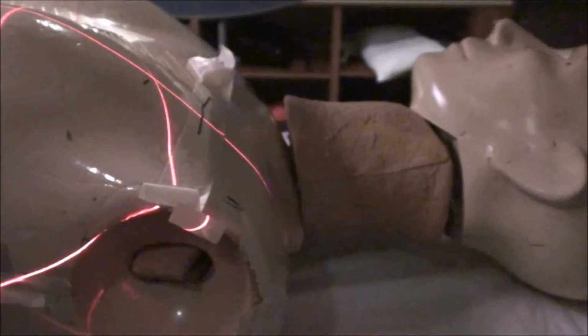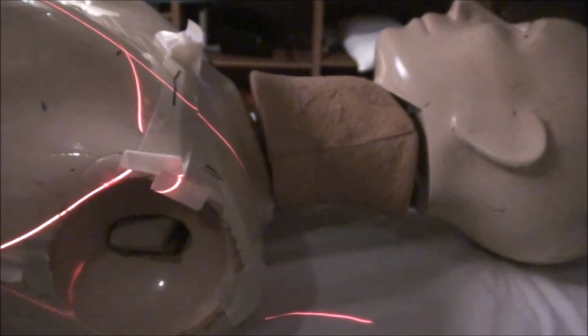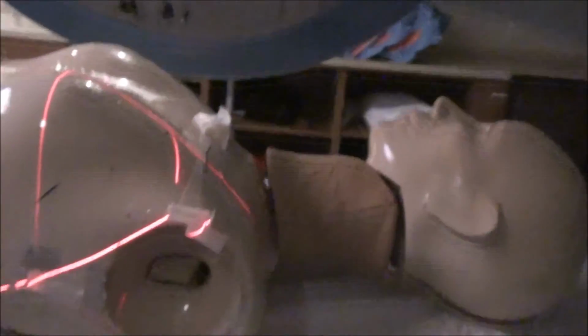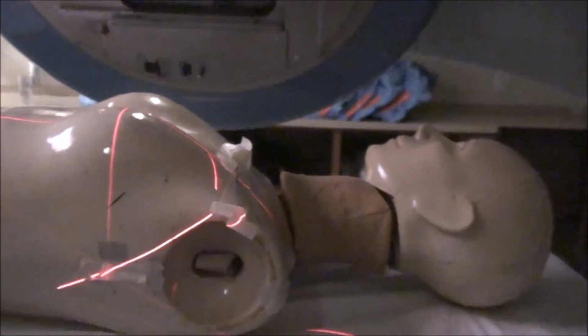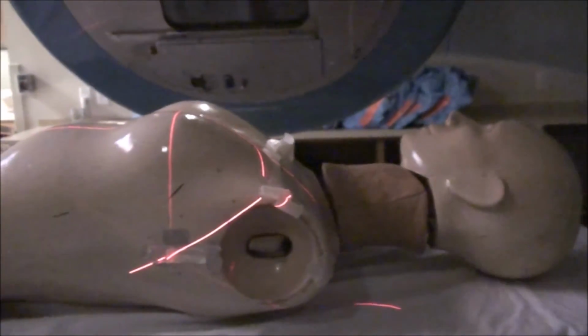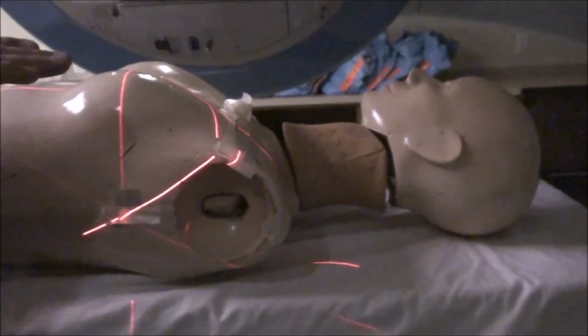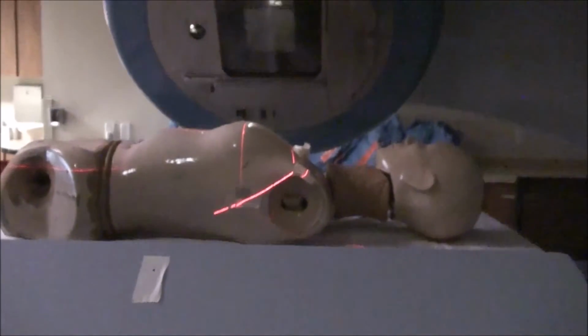Kick the feet away from the gantry. When you do that, you can now match that non-divergent line by having a table kick. So that was about 4 degrees off. We kick the table such that she is now lined up with the superior divergence of that field.